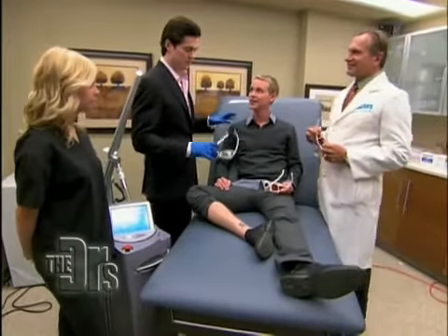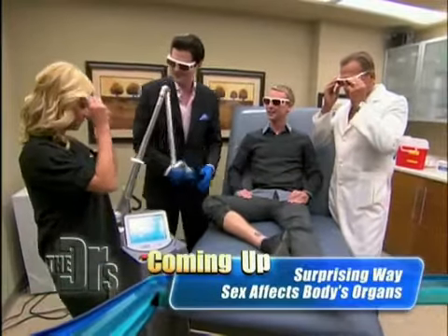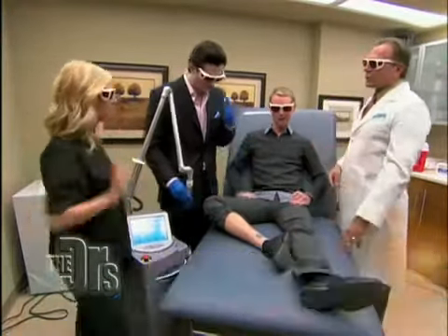I should preface this by saying most of my patients like to numb up. Josh has a really high threshold for pain, so we're going to move forward with no numbing. Absolutely not. Going into it, we're all good. Let's throw our glasses on. Okay. Nurse Sarah, are we set with the laser? We're all set. Okay, Josh. And this is the Q switch laser.